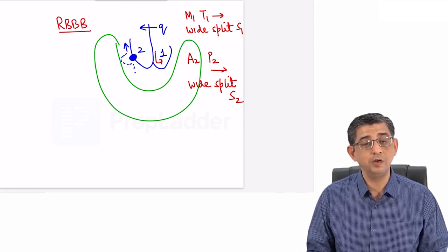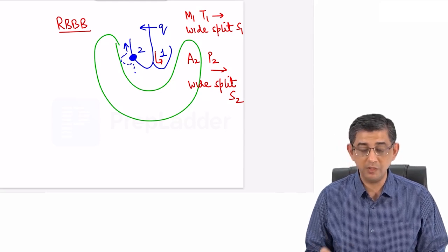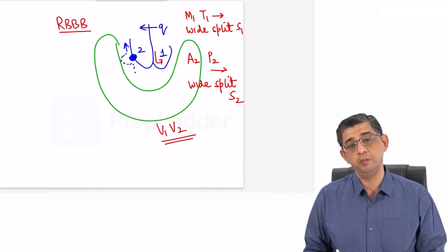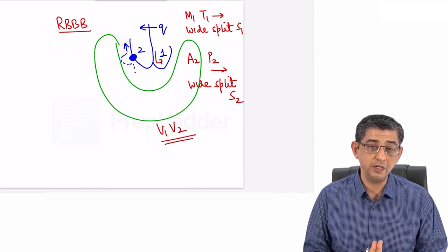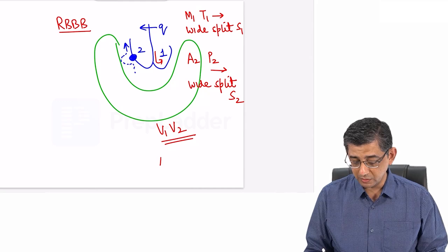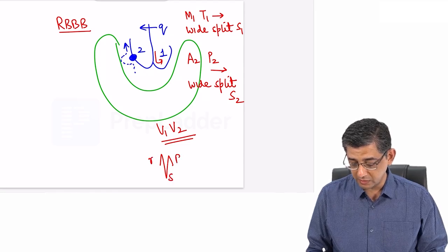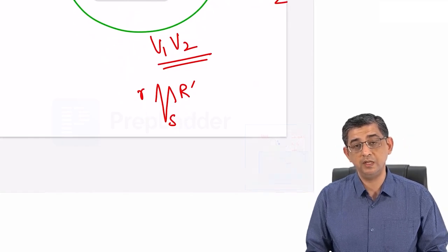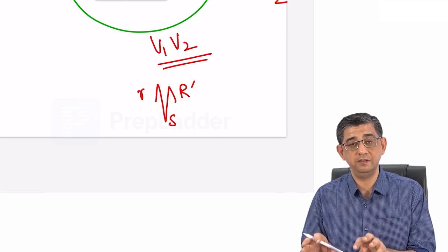Now, once this occurs in a patient, one of the predominant findings, especially in leads V1 and V2, will be based on the fact that there is not a simultaneous but a sequential activation of the ventricles. So we usually get this pattern. Again, it looks like rabbit ears, but is also written as RSR. In fact, these two R's represent the two different activations of the ventricle.